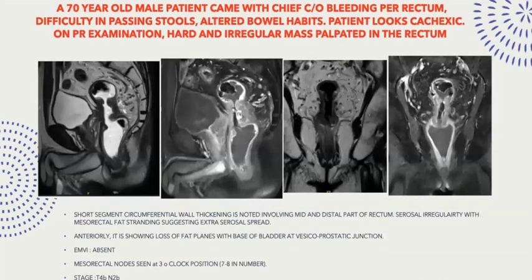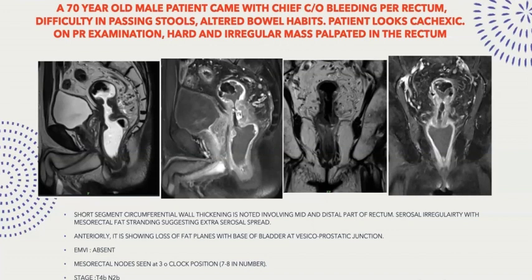A 70-year-old male patient presented with bleeding per rectum, difficulty in passing stools, and altered bowel habits. The patient was cachectic on examination with a hard irregular mass palpable in the rectum. MRI shows short segment circumferential wall thickening involving the mid and distal rectum. Serosal irregularity is seen with mesorectal fat stranding suggestive of extra-serosal spread. Anteriorly, there is loss of fat planes with the base of the bladder at the vesico-prostatic junction. Mesorectal nodes are seen at the 3 o'clock position, numbering more than 7-8. It is staged as T4B N2B.